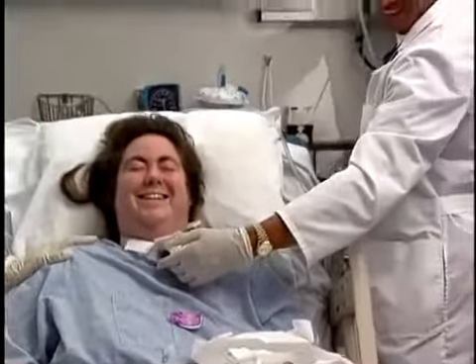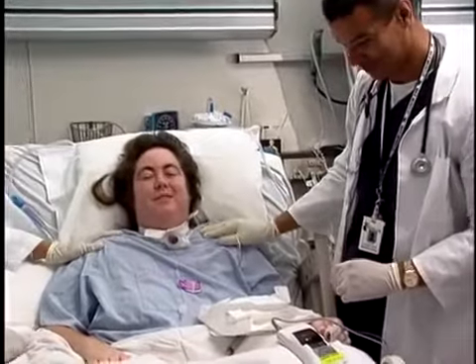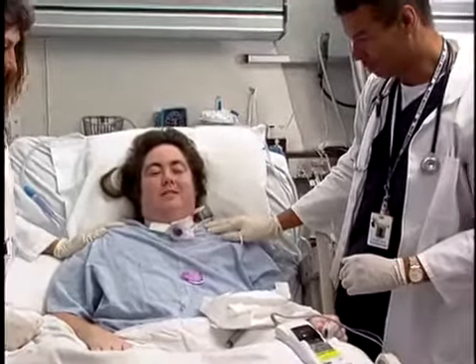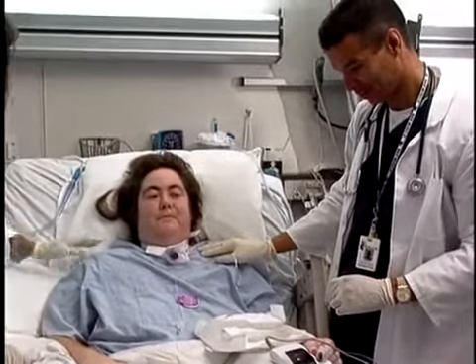Some patients are able to wear the valve for 15 to 30 minutes or longer on the first attempt. Other patients need to start more slowly, gradually increasing the time that the valve is worn by a few minutes each day.